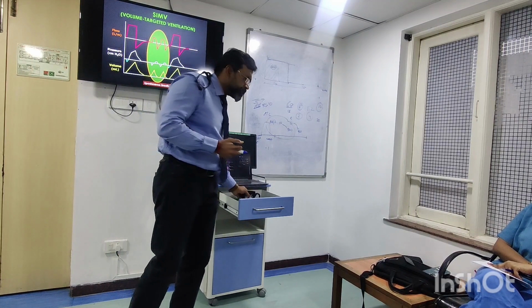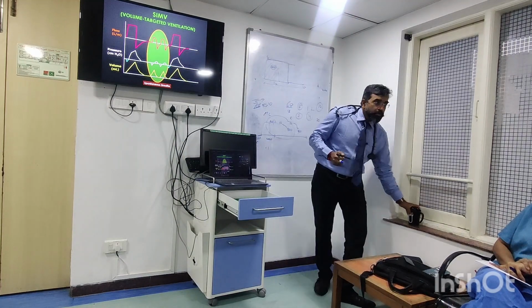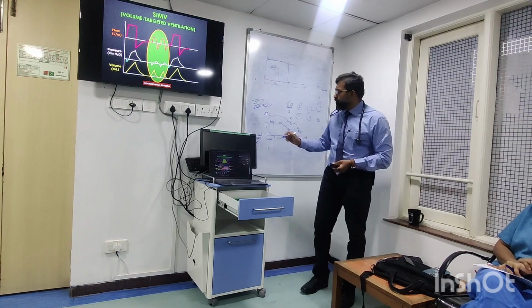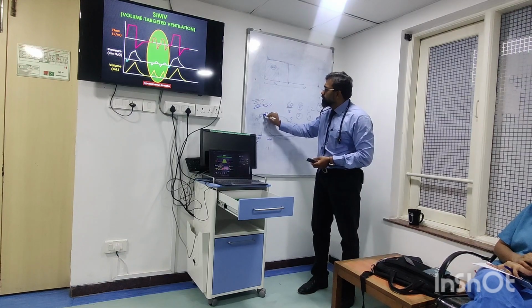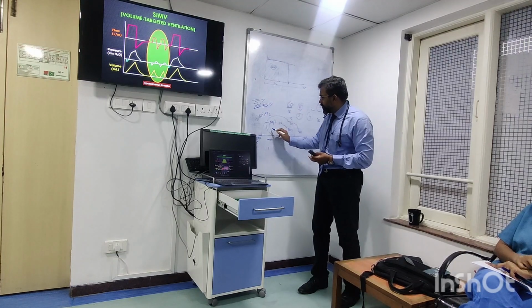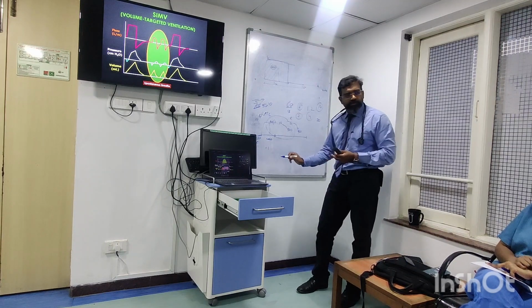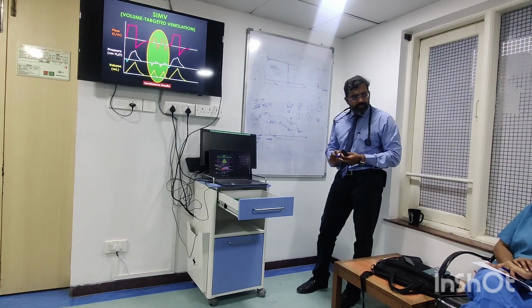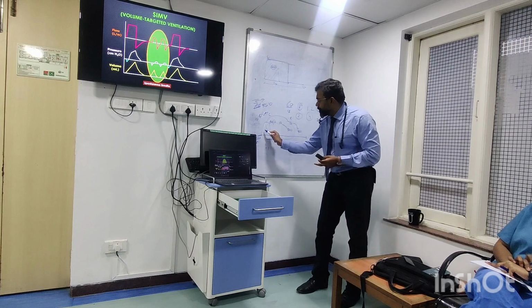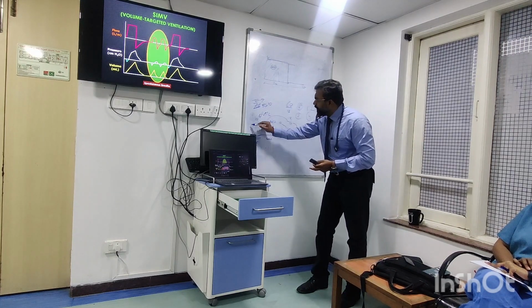Understood this? You are saying, sir, in the SIMV period, if the patient triggers, then it will give a breath. Yes, for a particular period of time, for whatever you have decided. You have decided to give a tidal volume of 500. Then the machine will allow the patient to breathe. So this is the entire period. Once it reaches this variable, then after the inspiratory phase, if the patient breathes, the machine will not trigger a breath, because this is the period that you have set. So say for example, it takes this breath and comes down here. So it has given the mandatory volume of 500.